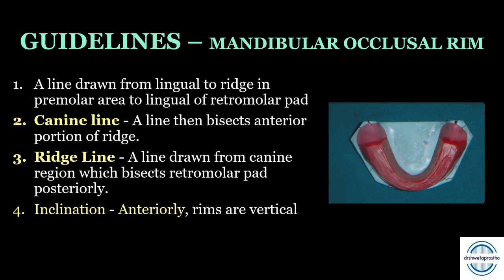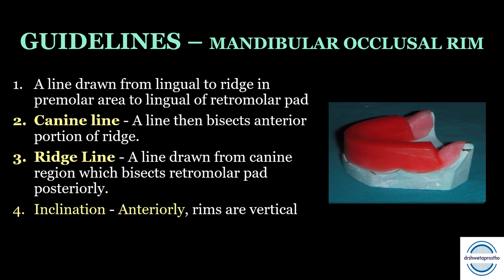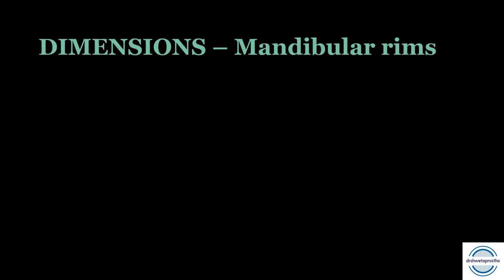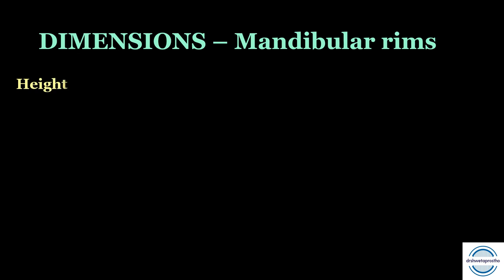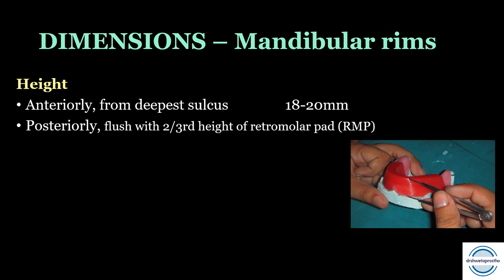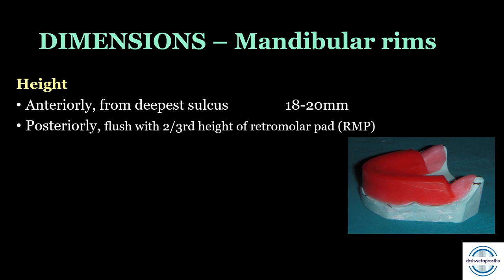Anteriorly, the mandibular rims should be inclined as vertical as the lower incisors, which are vertical on the ridge; posteriorly, the rims should incline towards the ridge crest. The rims should also follow the arch form. For mandibular rim dimensions: the height anteriorly from the deepest sulcus should be 18 to 20 millimeters; posteriorly it should flush with the anterior two-thirds height of the retromolar pad, dividing it into three equal parts.